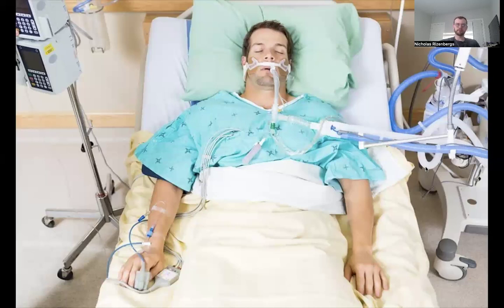So first, I want to make sure that he is in a position to even start this weaning process by doing those assessments. And then once we do that, I want to monitor him during that weaning trial by checking his heart rate, making sure his heart rate isn't increasing by 20 or going down by 20, that his SpO2 isn't dropping by 4%, and make sure he's not showing any signs of increased work of breathing, that he's diaphoretic, he's sweating, I'm seeing retractions, and he's seeming agitated.